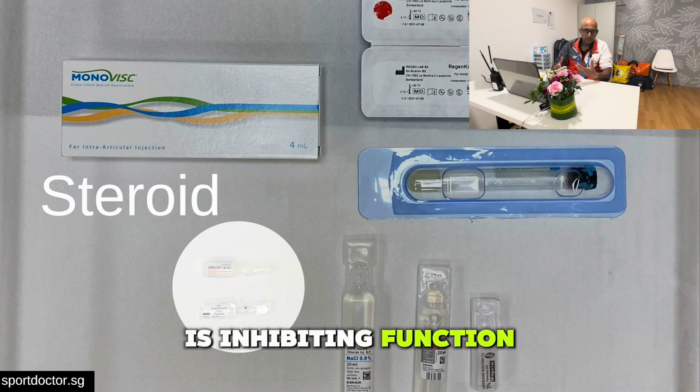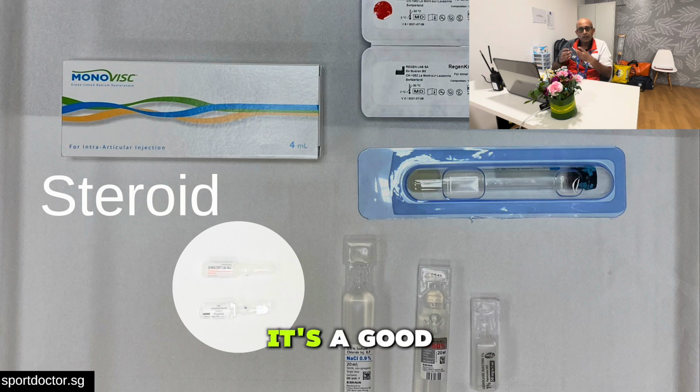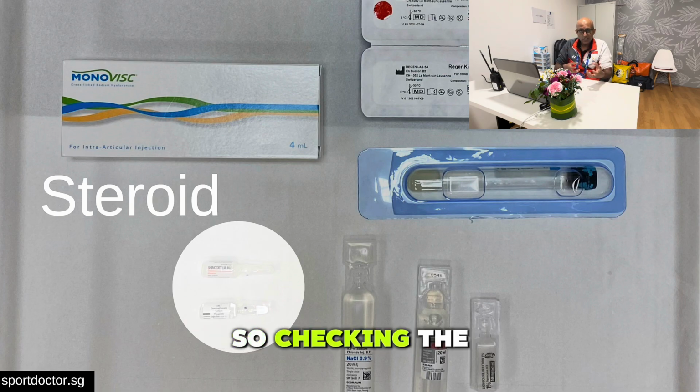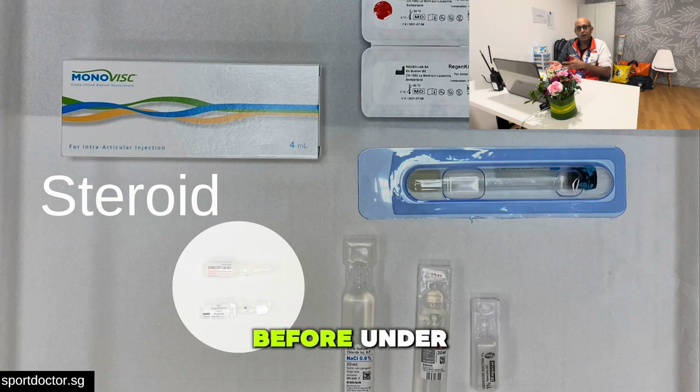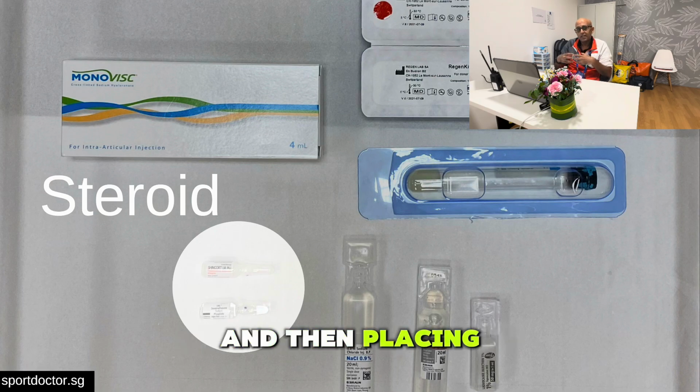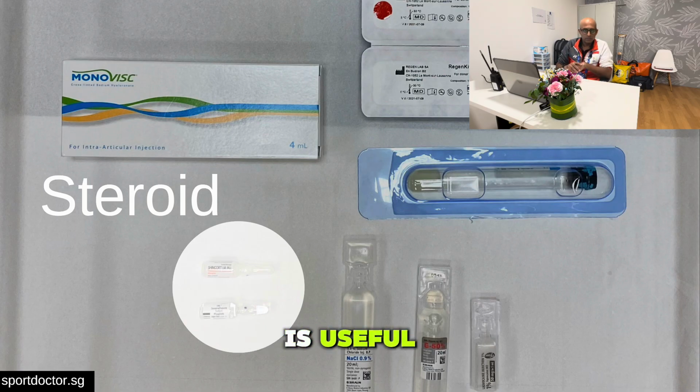or whether there's acute pain which is inhibiting function. It's a good idea to obviously learn to scan the structure before you put steroid around it, because if there's any tearing of it, the side effect of the steroid may be to weaken it further. So checking the structure is intact or just irritated before undertaking the steroid injection is important, and then placing the steroid as close as possible to the structure but not within it so that it disrupts it is useful.